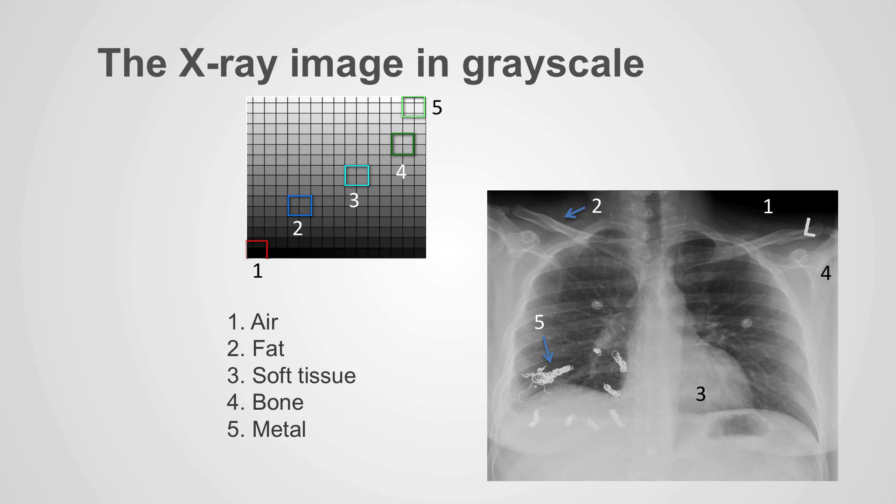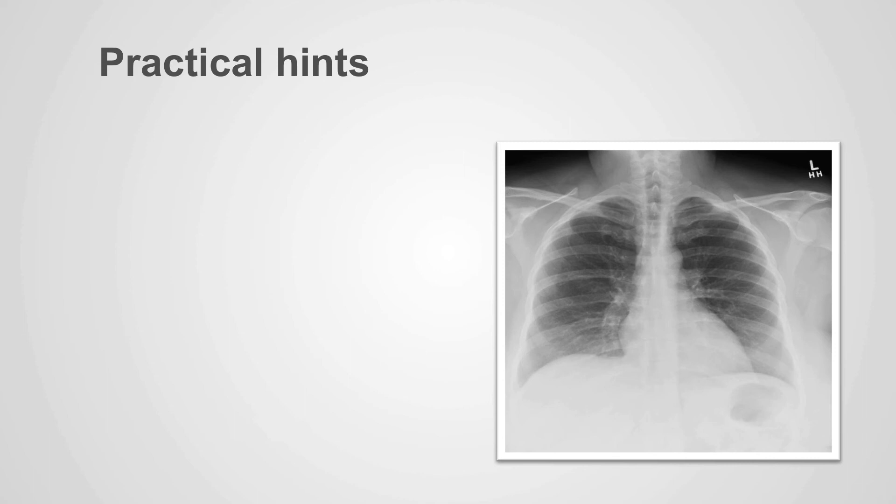The fourth density which is not natural to the human body is metal density and we can identify these metal coils that have been inserted into this patient for treatment of vascular malformations. So some practical hints related to the grayscale of an x-ray examination. Looking at this image, we see that there's very black areas above the shoulders. This represents air that is within the room, so we can expect that the air within the lungs will also look black.